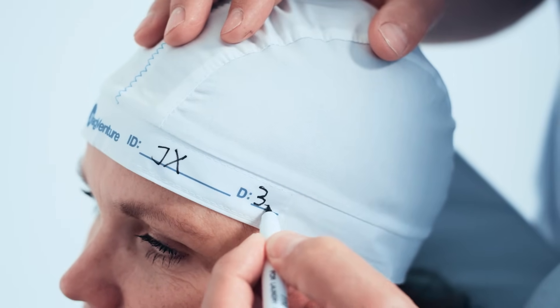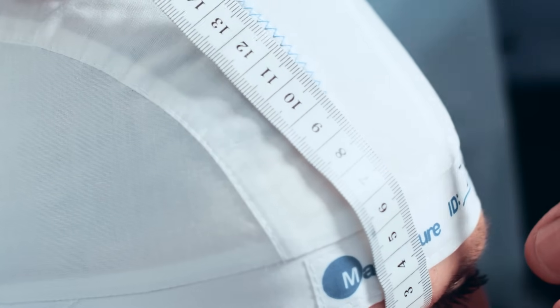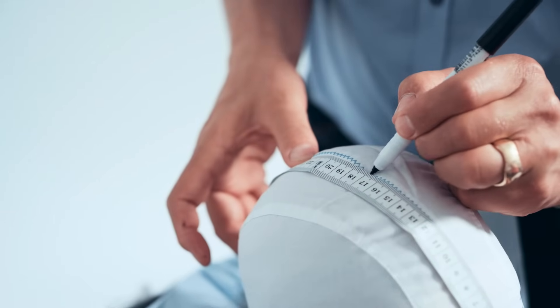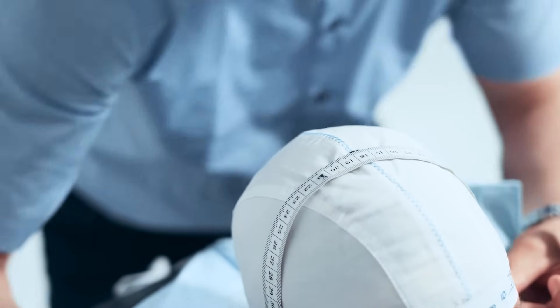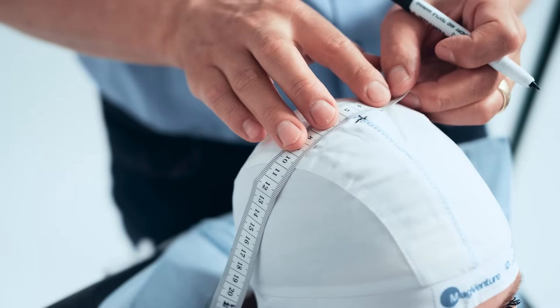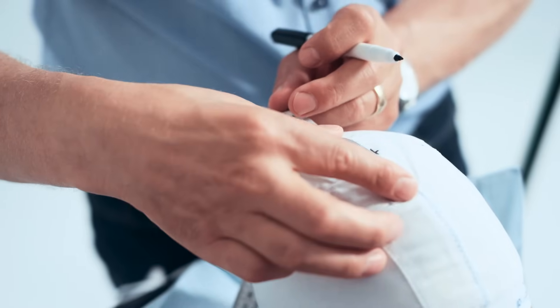Write the distance from the nasion to the edge of the cap on the cap. The inion is the most prominent projection of the occipital bone at the lower rear part of the skull. Measure the distance between the nasion and inion along the midline of the head. Locate the halfway point between these two landmarks and mark it on the cap. Next, measure the distance between the tragus of each ear, with the imaginary line joining the tragi passing through the halfway point between the nasion and inion. Find the halfway point between the tragi and mark this as the vertex. The motor cortex for the right thumb is located to the left and front of the vertex. Make a mark on the left side of the patient's head, 5 cm lateral to the vertex along the imaginary line joining the tragi of the ears.